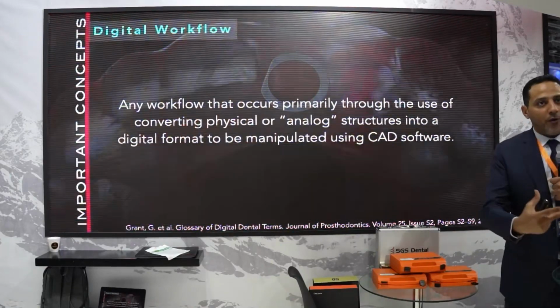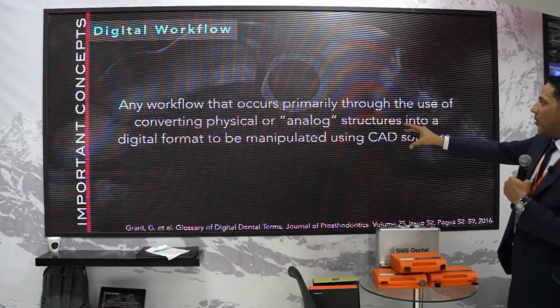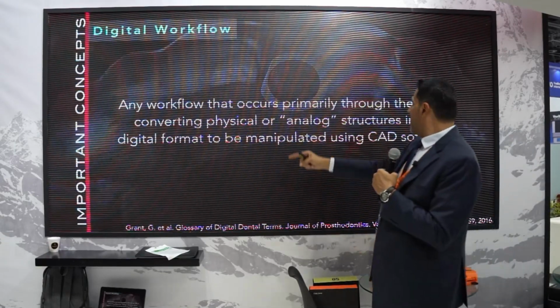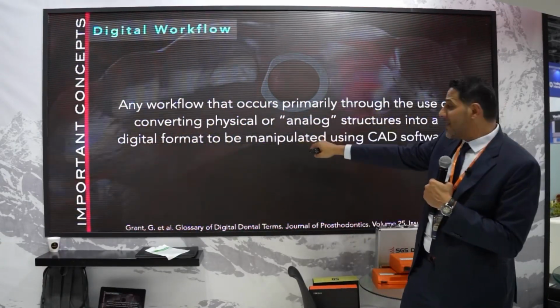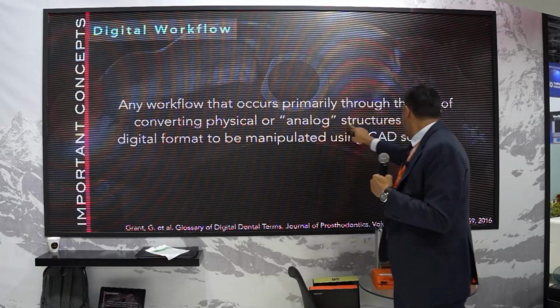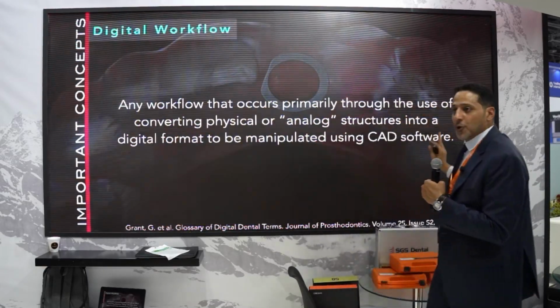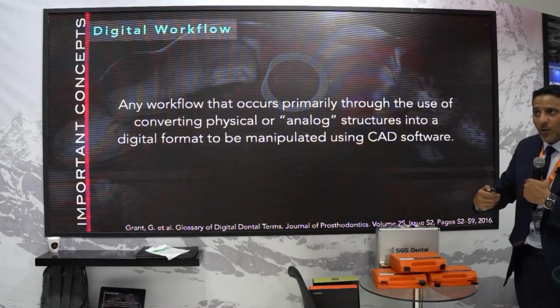What is the digital workflow? It is any workflow that occurs primarily through the use of converting the analog, which is the conventional one, into a digital format using the computer. Okay? This is the digital workflow.